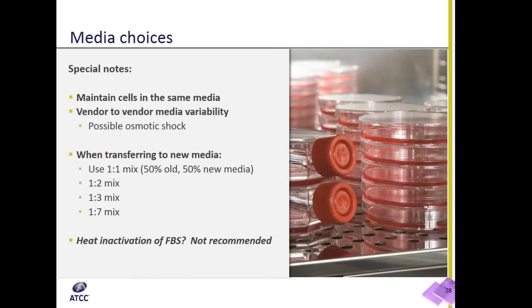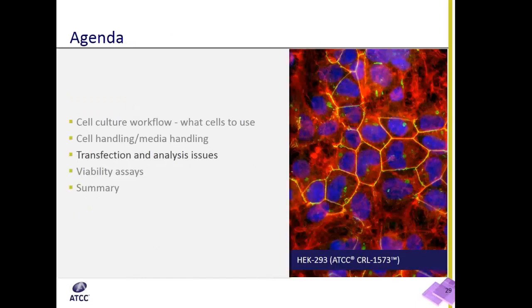For all animal serum, we generally recommend that you do not use heat inactivated FBS unless there is a good reason. Heat inactivation is shown to be detrimental to growth factors and hormones. Recommendations to heat inactivate serum have been based on the need to inactivate the immune complement. This really is only useful for certain applications, such as using cells to assay viruses.